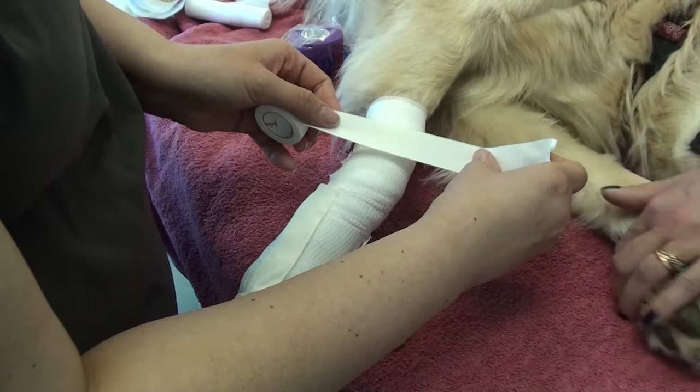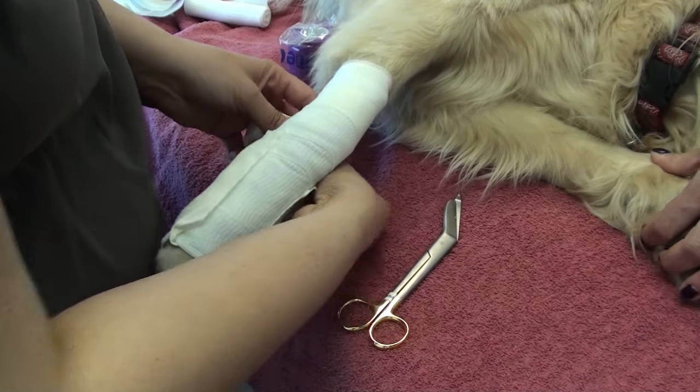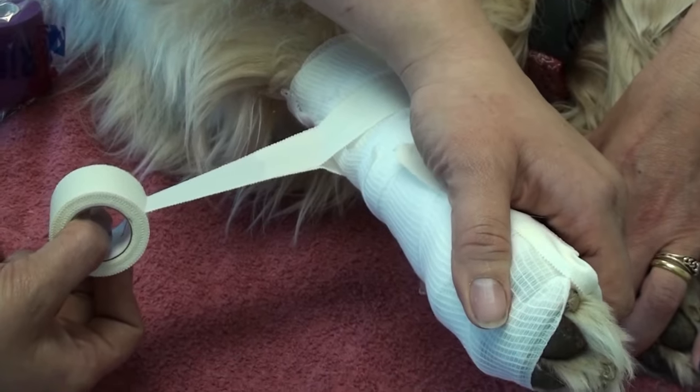Now she is starting to apply the carpal flexion bandage. Again, she starts with a loop rather than wrapping around the radius.